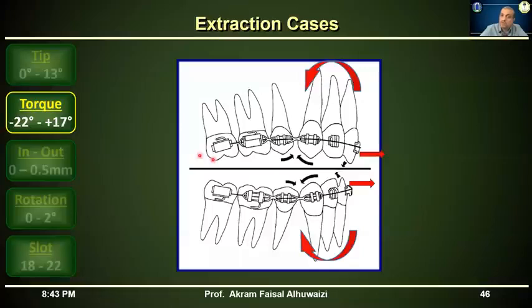This also drains the anchorage. So the same thing counts. You should count your anchorage. The same thing with the tip. But there's a difference here. With the tip, it happens from day one, from the initial tie wire. So you needed to put probably a lace back or a TAD and ligate the canine from day one.